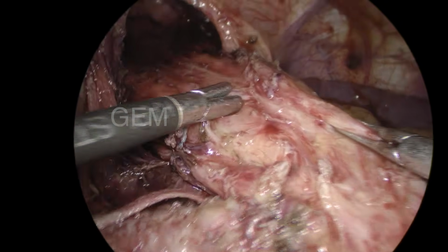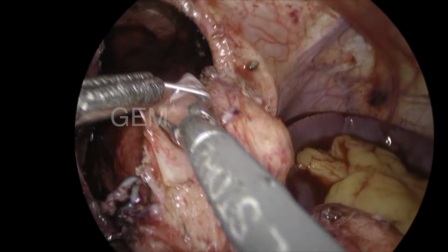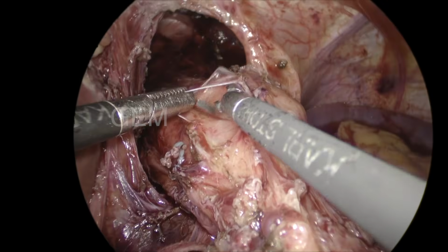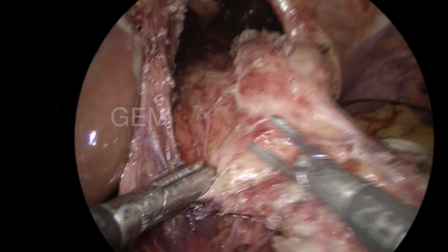You can see when I am doing myotomy, I am not giving traction with the umbilical cotton tape, and I am not tying the cotton tape around the OG junction. In fundoplication, I used to tie it. Here I am using the cotton tape only for traction. And you can see the anatomy is very clear now.